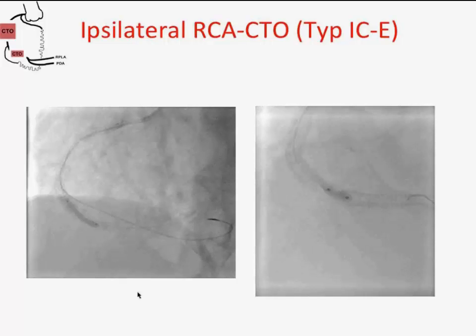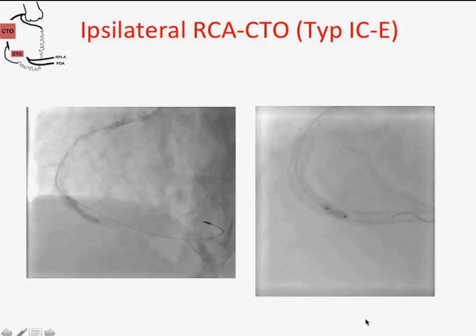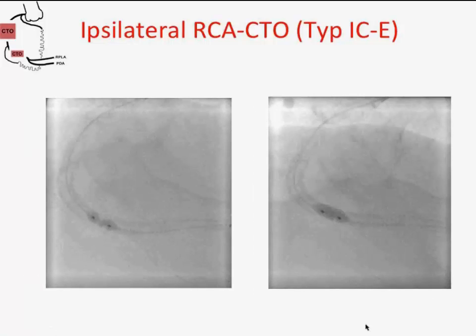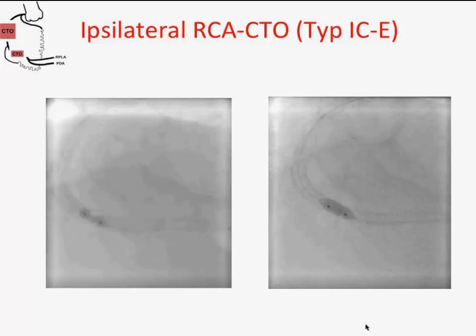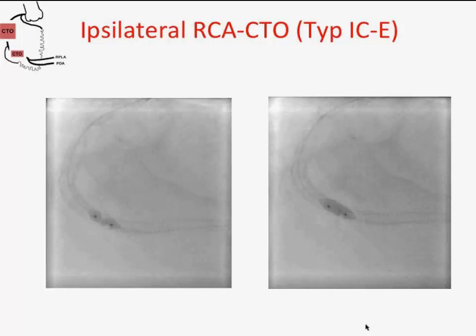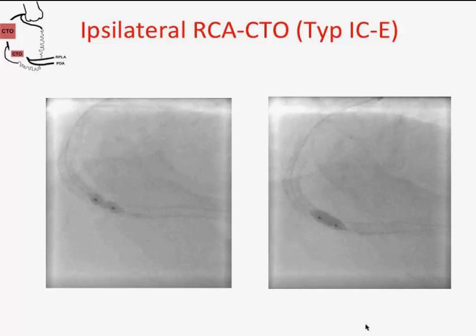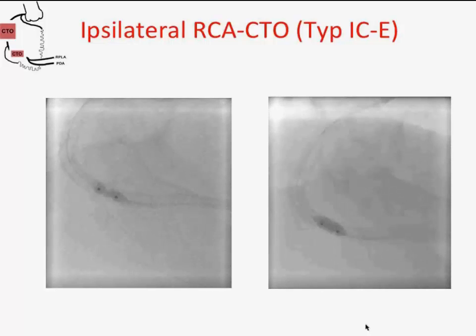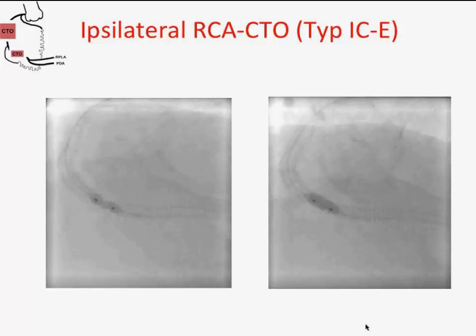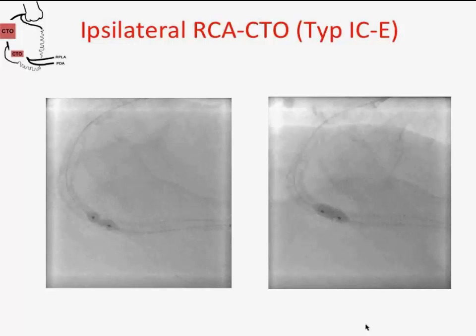And finally, after balloon dilatation, I realized that a 4-0 balloon I couldn't expand. And this is a cutting 4-0 cutting balloon. We shouldn't go up with this Flex no more than 10 atmospheres, but I have to tell you the truth, it was 24 atmospheres in 3 minutes of time, which I waited, then it suddenly went bloop, and it opened up.